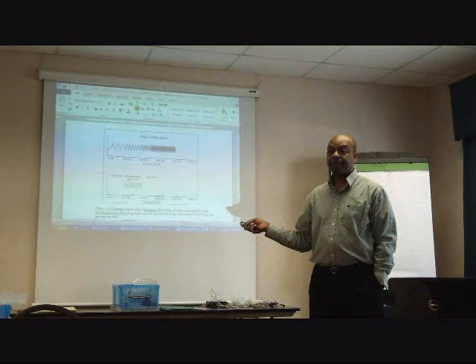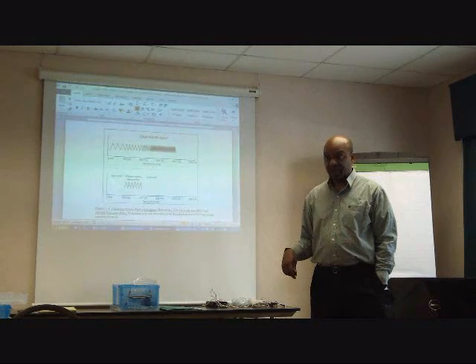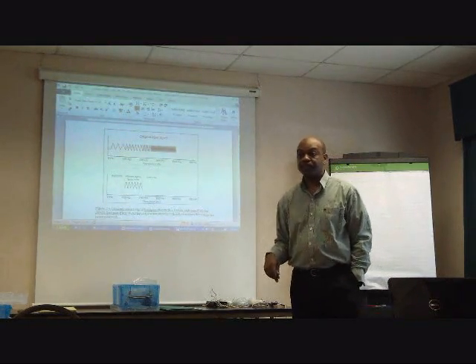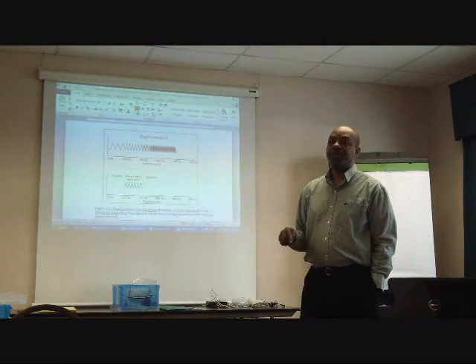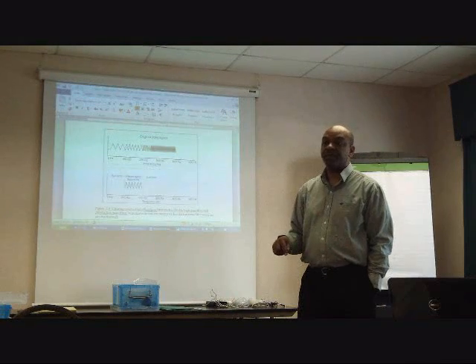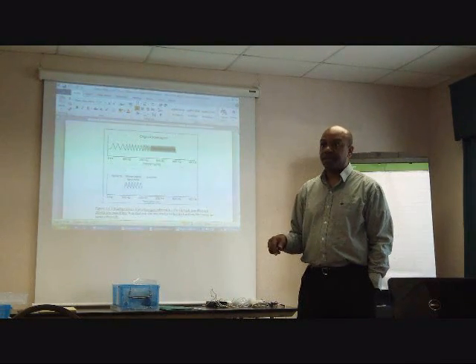What I was inferring, maybe it's wrong, is that when you have a wide pass, you get more artifacts, like the heartbeat. So when you're using a wide pass for a vaginal sensor, wouldn't you get the heartbeat and lots of artifacts? No, you would tend not to get it. If you're further away from the heart, you tend to get either less of it or none of it.